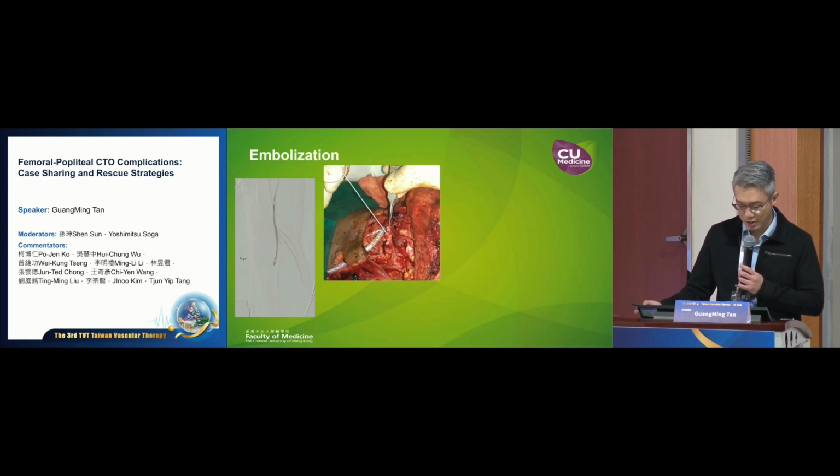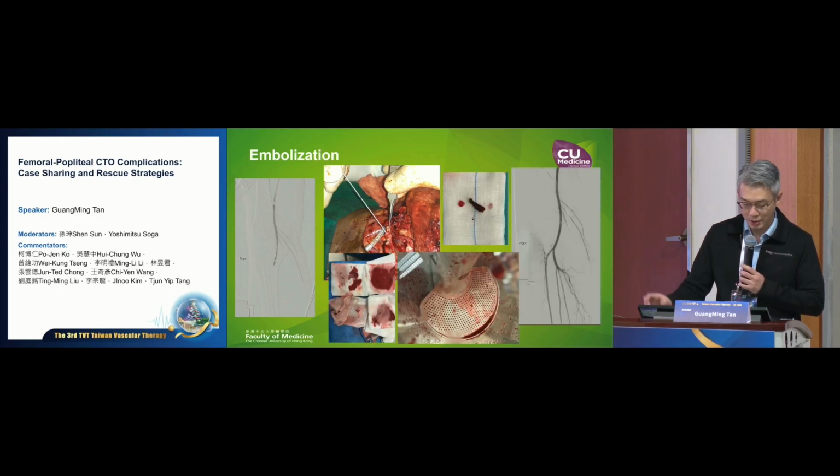But in other cases, if the embolization happens in the major artery, such as in this case, which is embolization of the distal popliteal artery after a thrombectomy procedure, then you would consider embolectomy. So in the past, of course, you can ask a surgeon to do a Fogarty embolectomy, but in this case, we can simply use our suction catheter to aspirate some of this embolic material out.